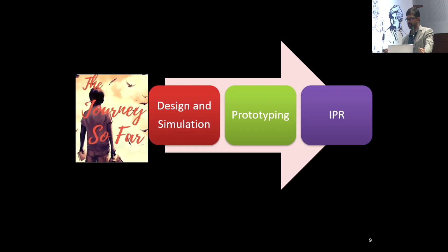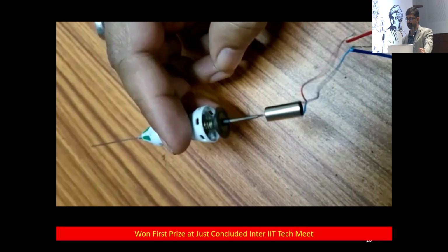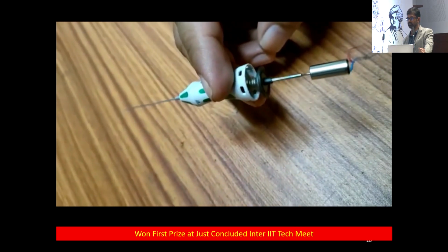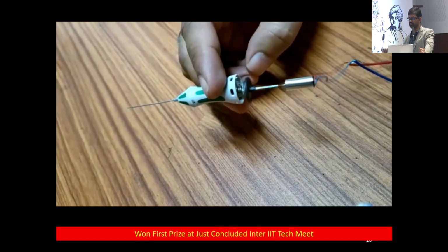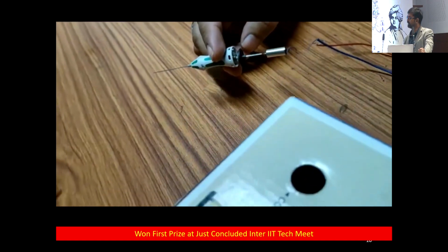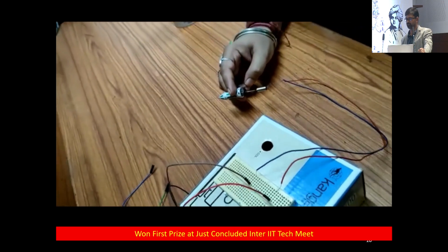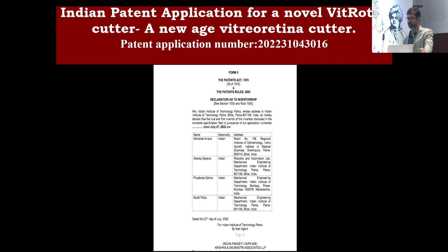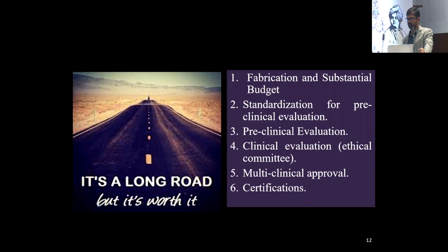So till now, we have crossed some parts of the journey like design and simulation, prototyping, and the IPR. So this is one of the first prototypes, for which we used a 23 gauge vitrectomy cutter, which won the first prize at the just concluded IIT TechMet. And we used the actuator and the coupler to show that it can actually work. This is our patent number, which is under process. But overall, it's a very long road, and the main hurdle is the fabrication and the big budget that you require for it. So we are working on this.